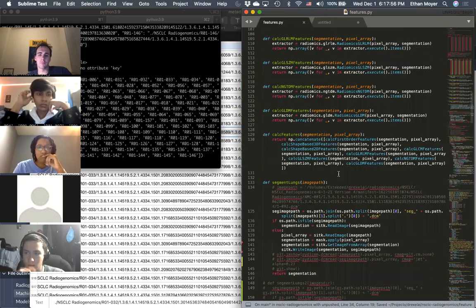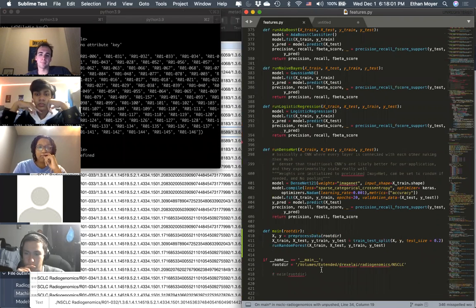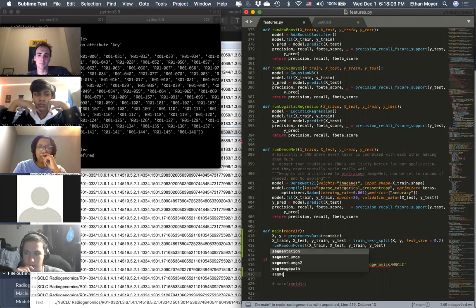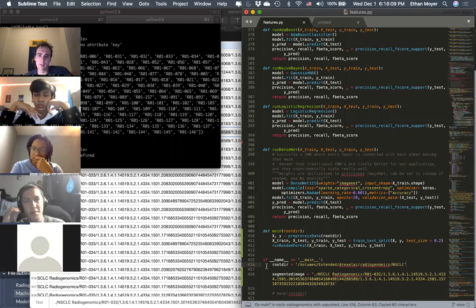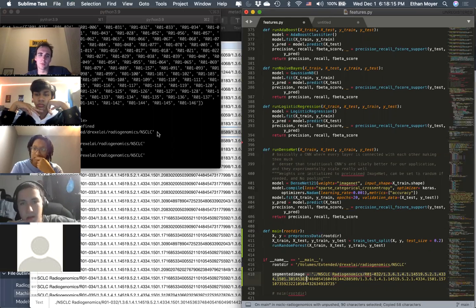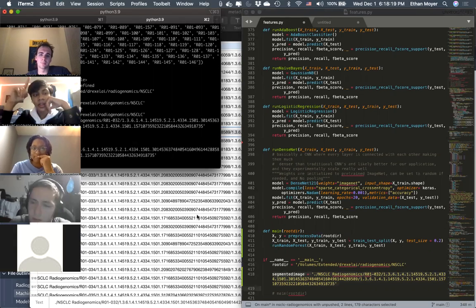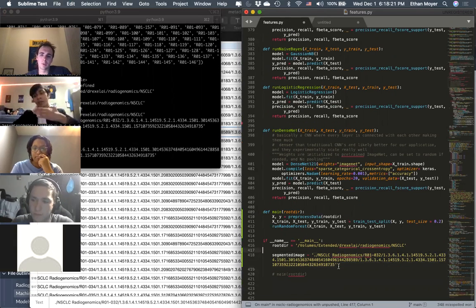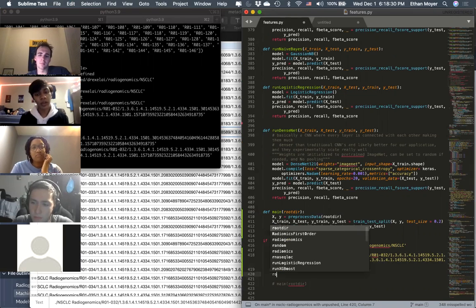Yeah, but we've got to have a test for a segmentation. Yeah. Are you saying it only segmented one slice when it's supposed to segment all of them? No, maybe they gave us an image of only the face with the maximum area or something. I don't know. Because I was trying to access the segmentation online, but I couldn't open it.